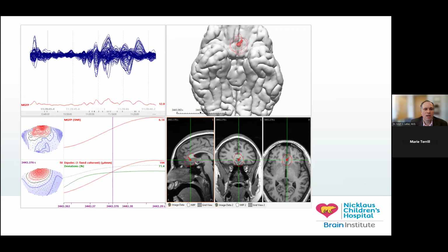But we did end up finding this dipole here that I'm showing for this small spike. So this dipole is relevant. It's sort of hard to understand just taking a look at it because it shows up right in the center, with that negativity in the center but kind of pointing up and toward the left. Meaning that the positivity is pointing up and to the left, meaning that the dipole is directed down towards the base of the right frontal lobe. And there actually was a finding that we got on our pre-surgical MRI in this region here, right here at the base, just above the orbit.